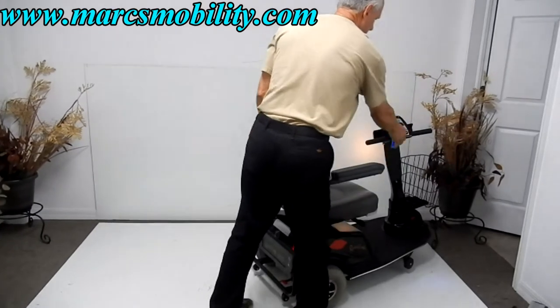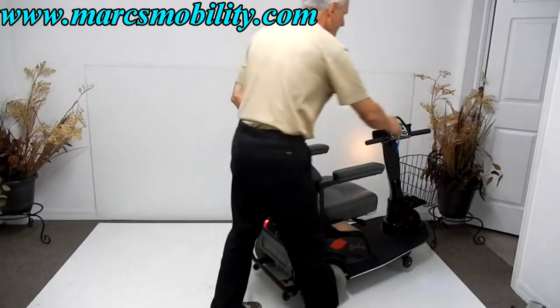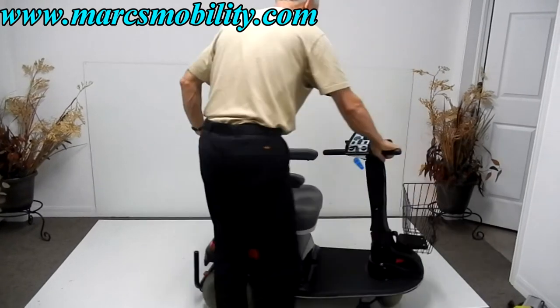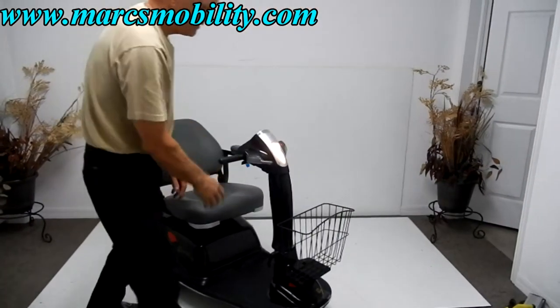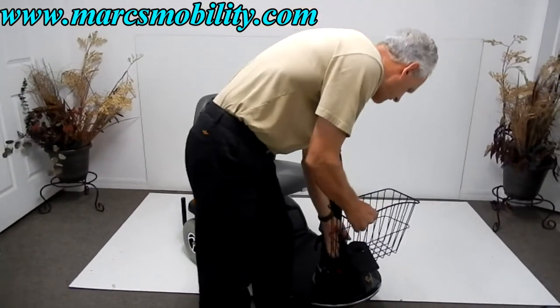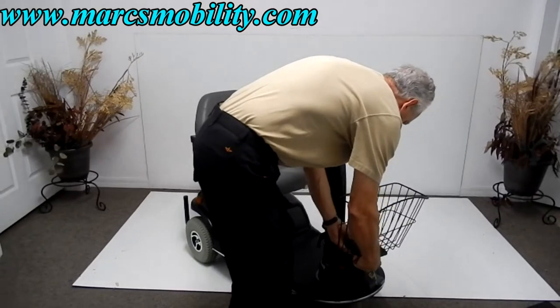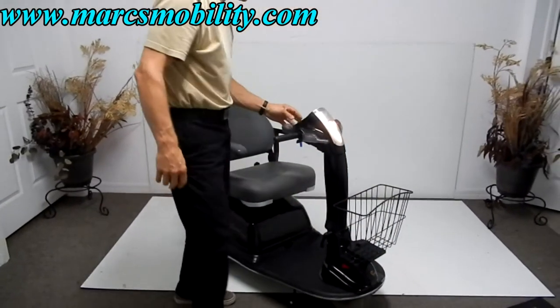Whenever you put a scooter or wheelchair in neutral, you always have to reset the key and reset the computer afterward. This scooter also has a removable basket. With two new batteries, it will give you 20 miles on a charge.